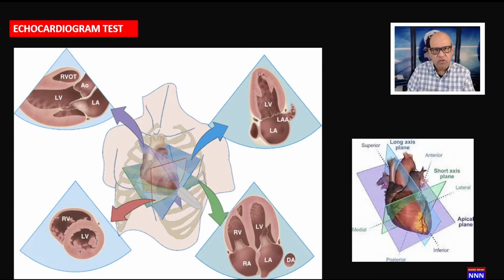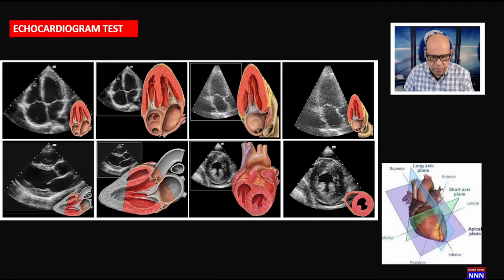But we're going to focus on 2-dimensional echocardiography because this is the basic study that every cardiology fellow needs to understand before you go into more sophisticated imaging process. So just to get sort of an orientation for the first time, if you're doing this, you can follow this bright green arrow. And here is the 4-chamber view.